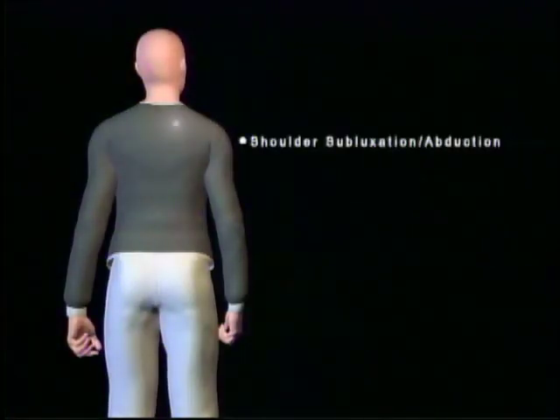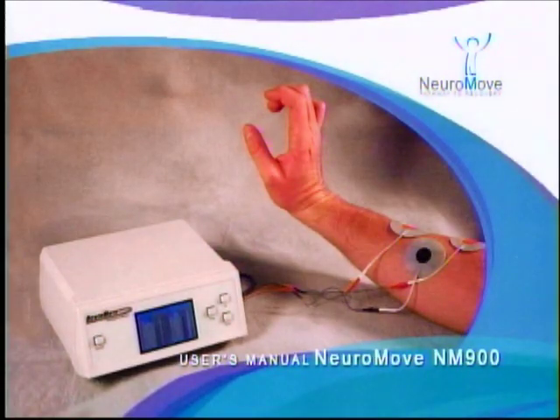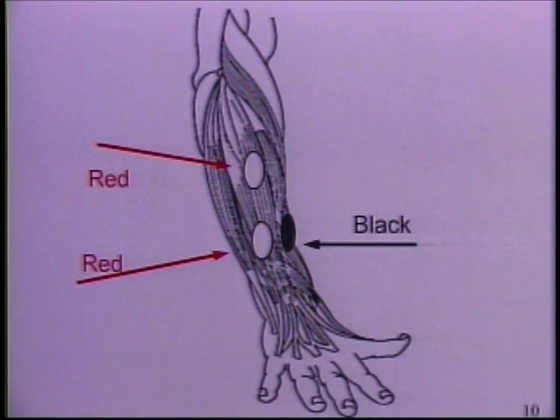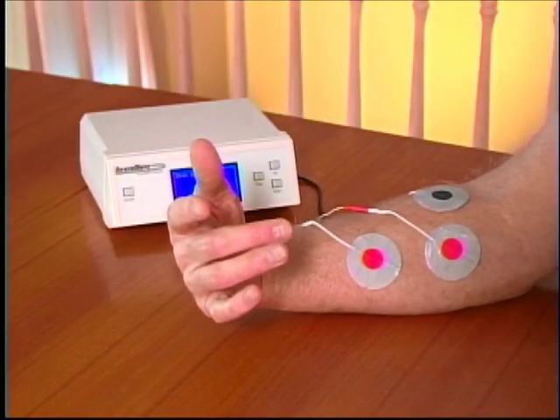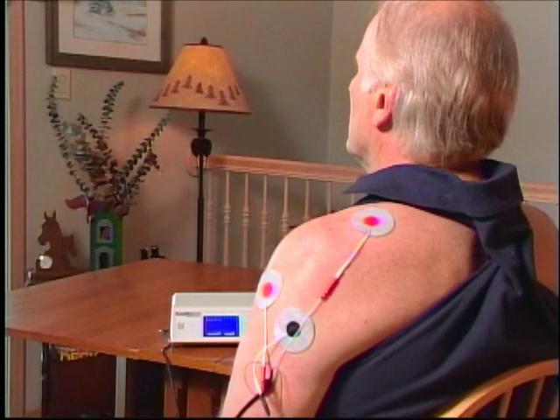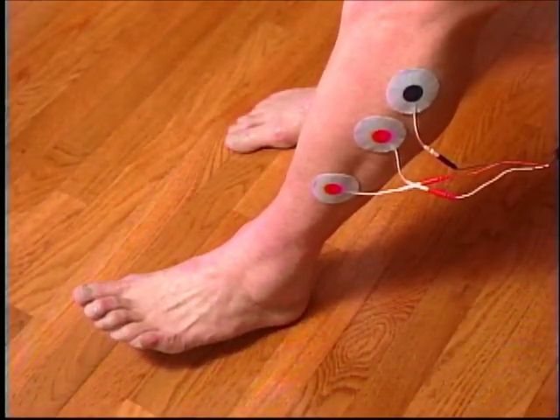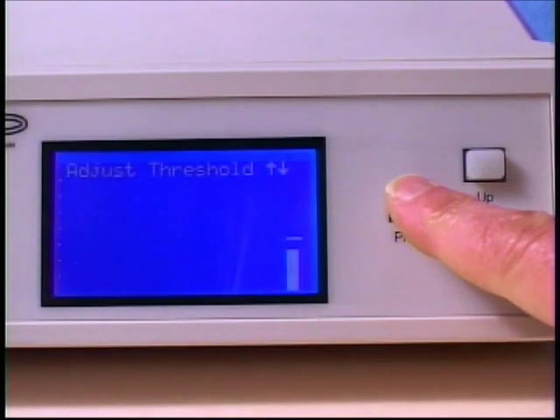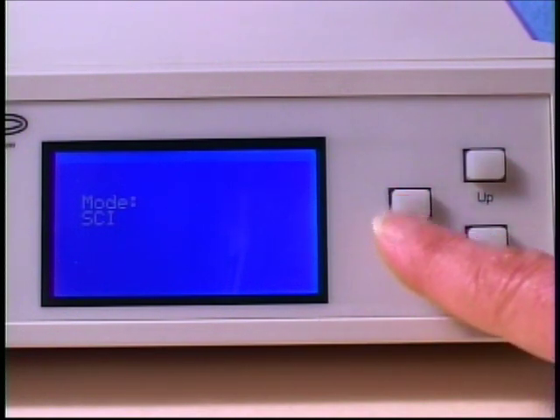The principles shown here are the same as those for other parts of your body. The NeuroMove user's manual provides explicit instructions on electrode placement for wrist and finger extension, wrist and finger flexion, elbow extension, back, shoulder subluxation, abduction, and ankle dorsiflexion. For spinal cord injury, you can change the mode to be five times more sensitive than stroke mode.